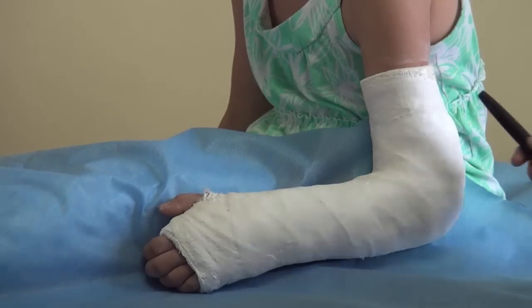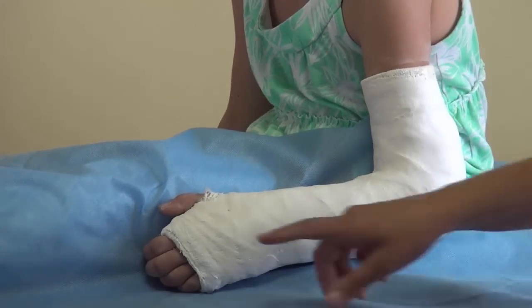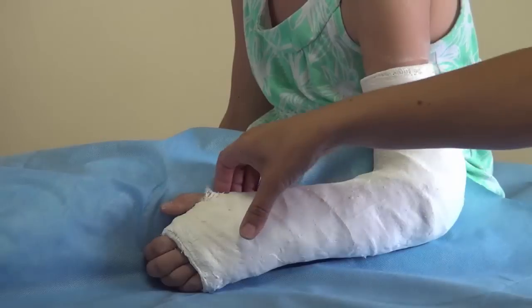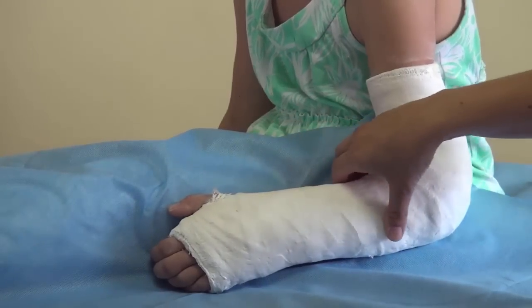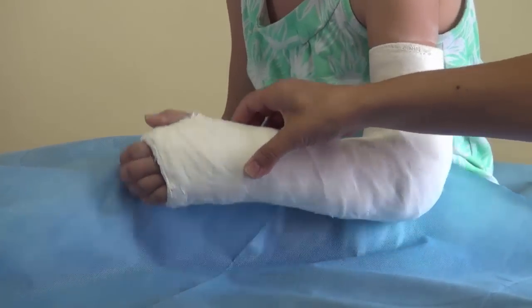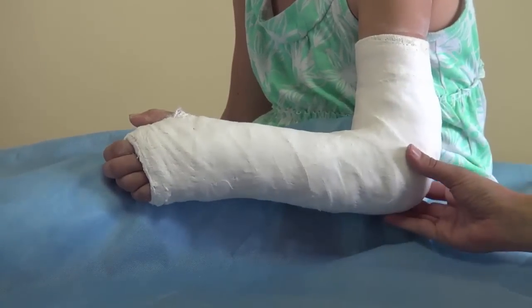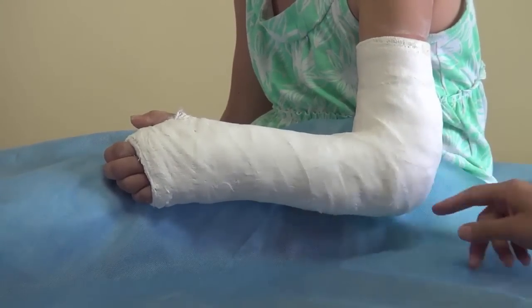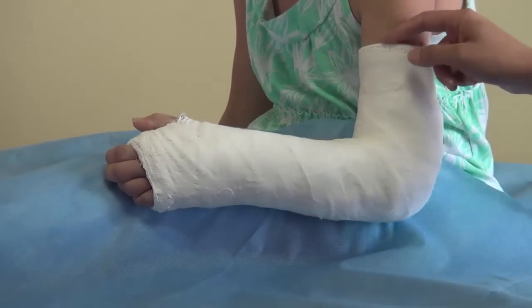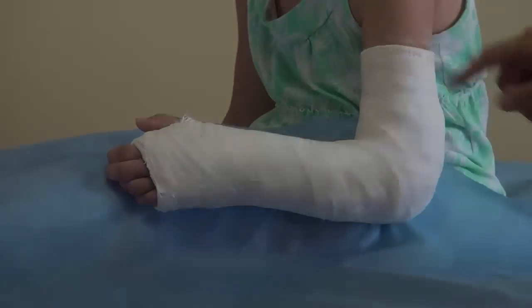This is the final result of a long arm cast with a well-shaped forearm, protected elbow, and also padded well at the ends of the cast.